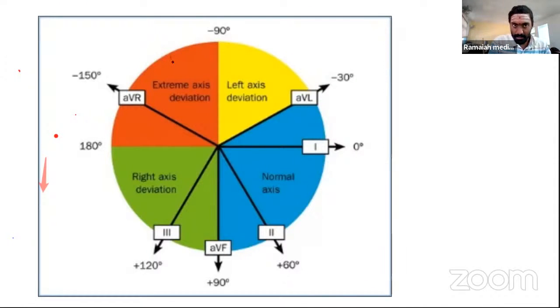This is going to be the direction of my lead 2. I'll repeat it. This is going to be my direction of lead 2. So if AVL here is a perpendicular lead to it, and there is electrical activity here, it is going in this direction. Exact perpendicular means lead 2 will be biphasic.